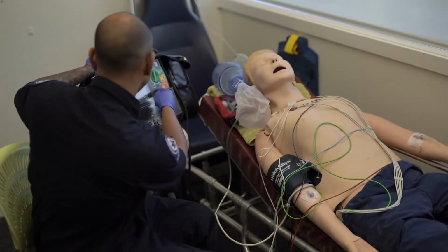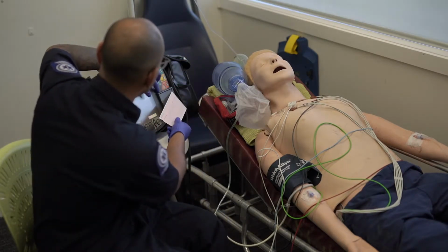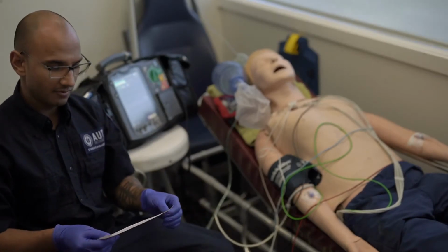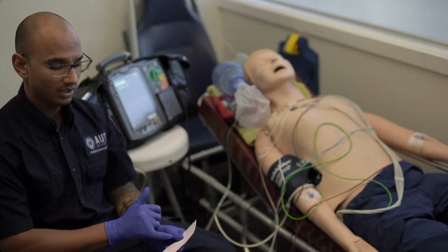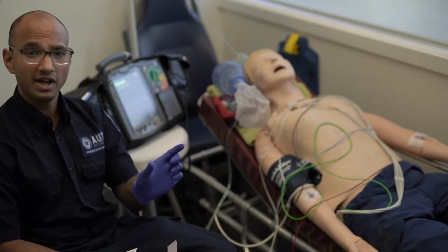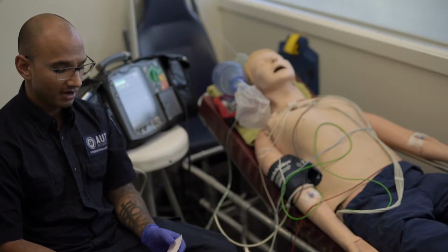Upon taking a 12 lead, it appears that our patient has got a rhythm that is very representative of VT. To confirm this, we need to make sure that our QRS is greater than 0.12, making it a wide complex tachycardia. He's got a heart rate of greater than 150 beats per minute, and there are signs of fusion and capture beats.